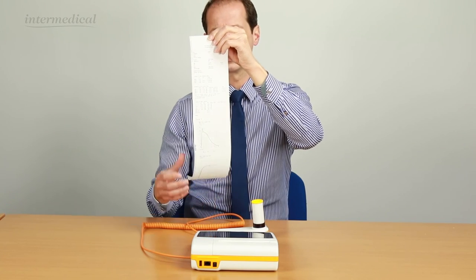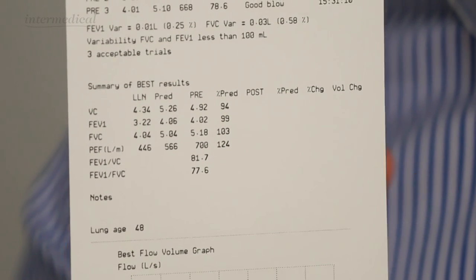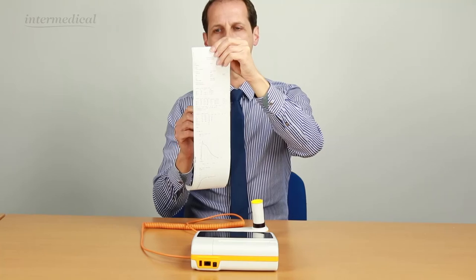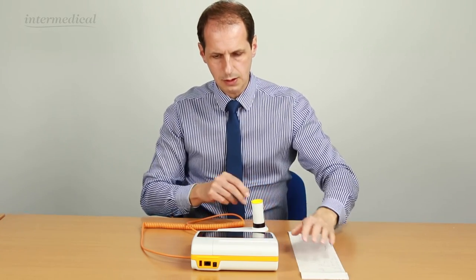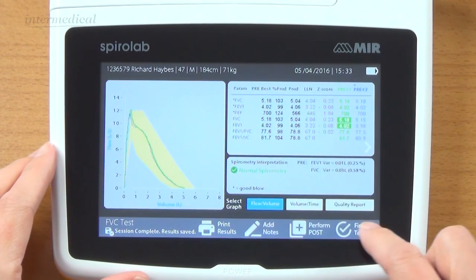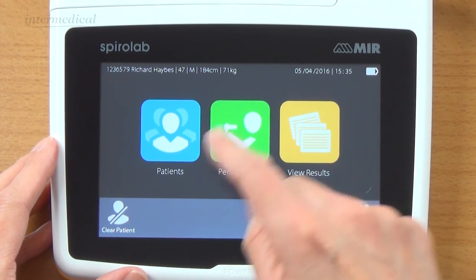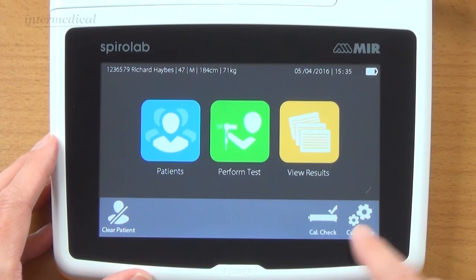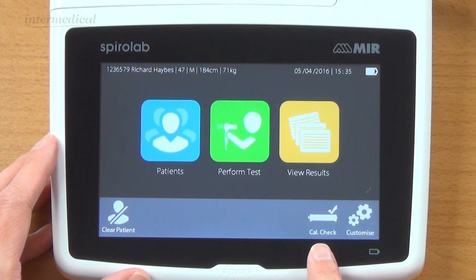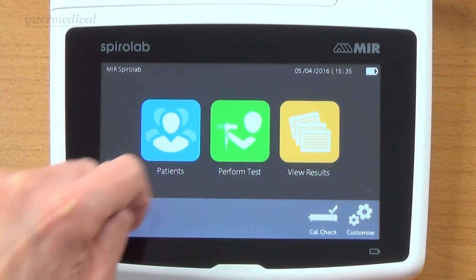Some other things on the printout: where you get the ratios, you don't see all of the predicted value, the lower level of normal, or the percent predicted - you just get the actual ratio, which is essential for not getting confused and muddled up. Now we've finished testing. We click finish test and we're back to the start. You can view the results for that patient, and if there were multiple tests you could view them all. Other options include a calibration check using a 3.0L syringe, and you can customise the device. If you clear the patient, it's now ready to start again.